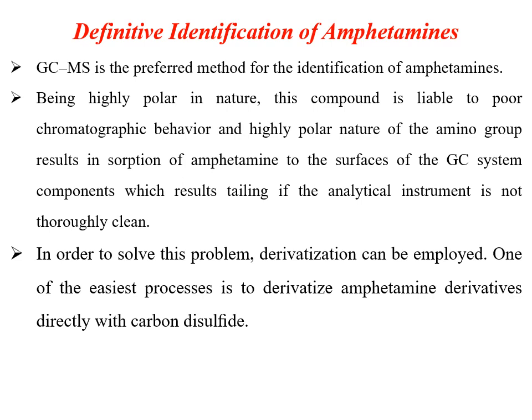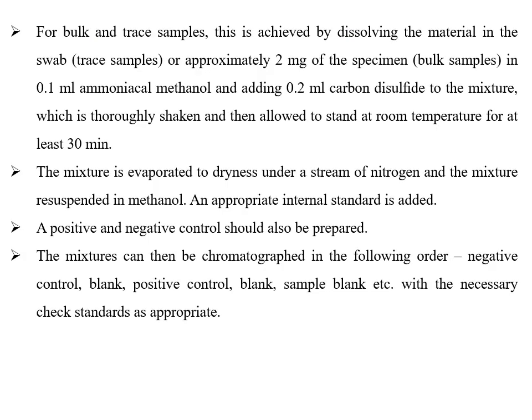These interactions result in tailing if the analytical instrument is not thoroughly clean. In order to solve this tailing problem, derivatization can be employed, and one of the easiest processes is to derivatize amphetamine derivatives directly with carbon disulfide. For bulk and trace samples, this is generally achieved by dissolving the material in the swab, or approximately 2 milligrams of the specimen, in 0.1 ml ammoniacal methanol and adding 0.2 ml of carbon disulfide to the mixture.